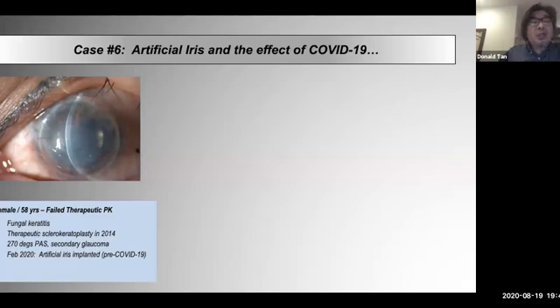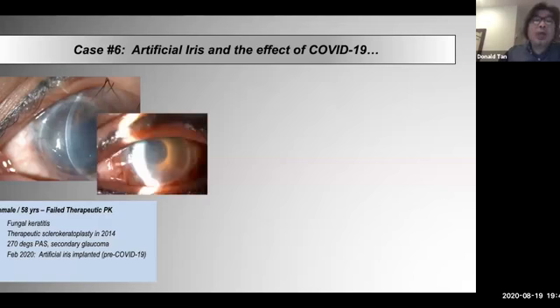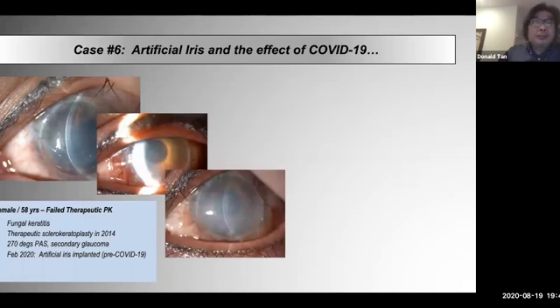I implanted the artificial iris in February this year, pre-COVID lockdown. This is what it looked like. This slide shows you why we need to stage the procedure. There's fibrin and a bit of blood. We need to get that all cleared up, which was all ready for DMEK. I ordered the cornea. It came in, got flight delay because of the COVID lockdown across the globe. It got stuck in Korea, basically, and that was it.